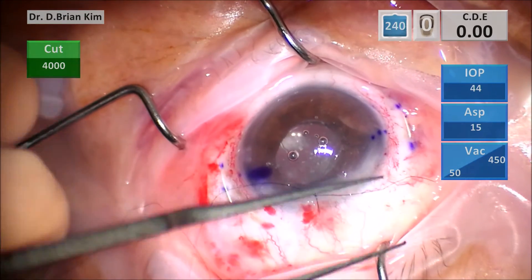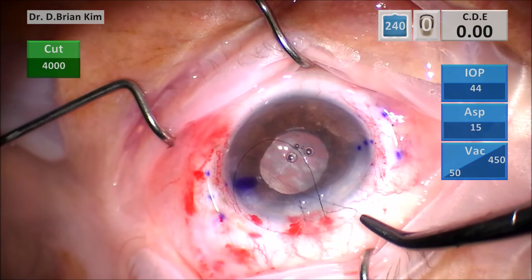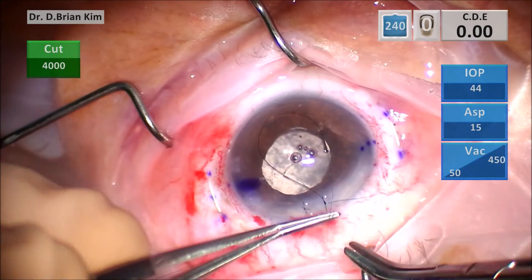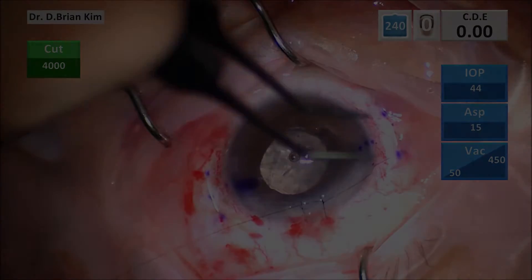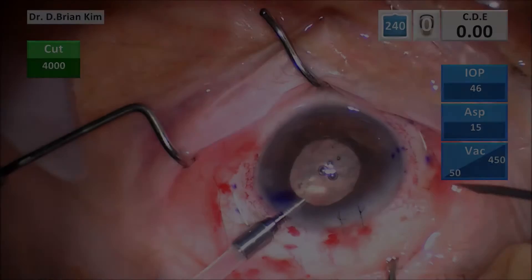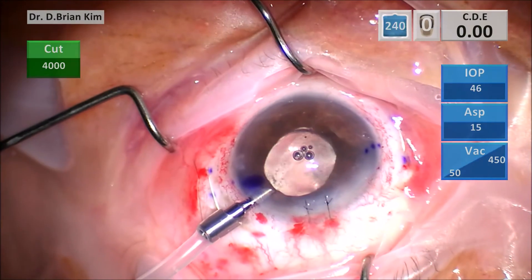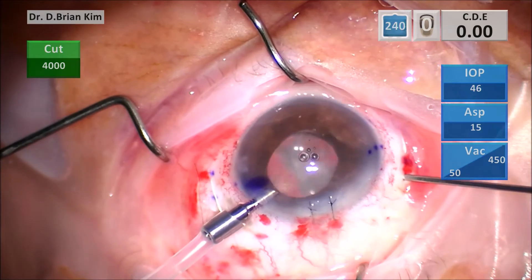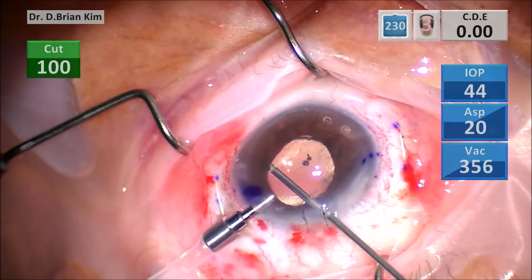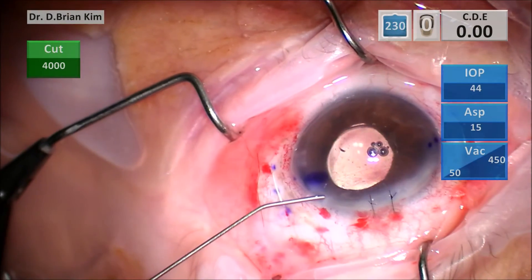This case took me a little bit less than an hour to perform. I spent a lot of time being cautious just because I wanted to be sure I was doing everything right, and obviously this video is highly edited. But I felt pretty comfortable with all the maneuvers — it wasn't an extremely tedious task. Just because I saw some triessence in the posterior segment, I made another sclerotomy, placed the Lewicki anterior chamber maintainer, and did a little bit more vitrectomy mainly to remove all the intraocular triamcinolone. I then went into the anterior chamber and removed the viscoat as well, and hydrated my incisions.